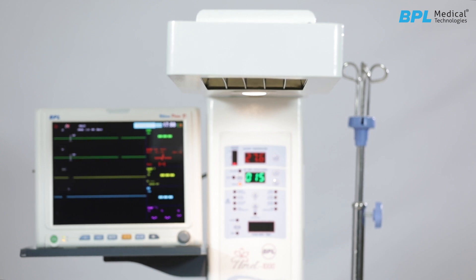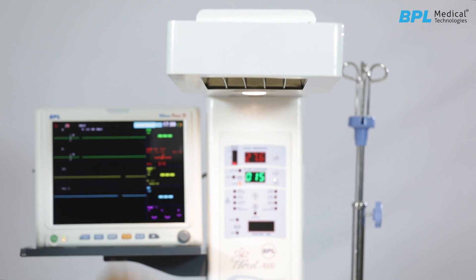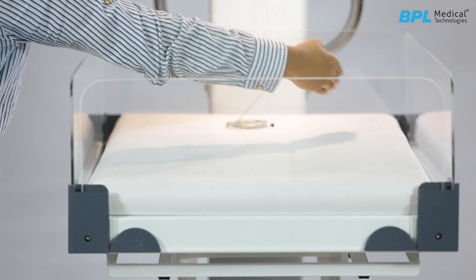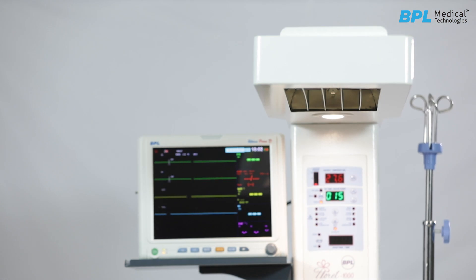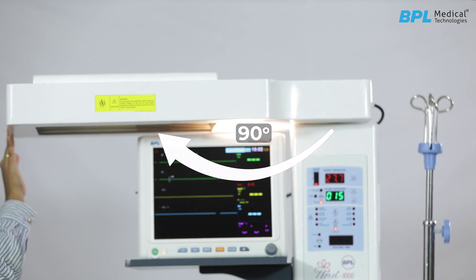In the Fluorate warmer, the parabolic reflector helps focus the heat towards the mattress surface area. The panels minimize heat loss from the baby. The Fluorate heater head can be rotated 90 degrees, making it easier to take an X-ray.